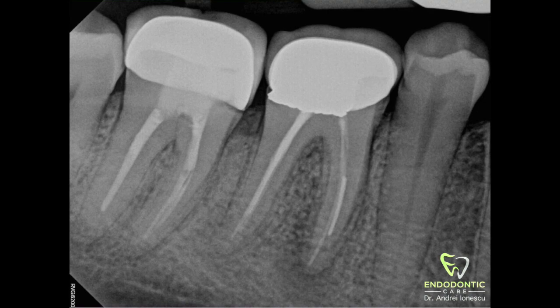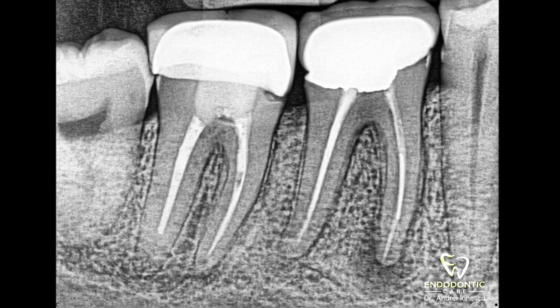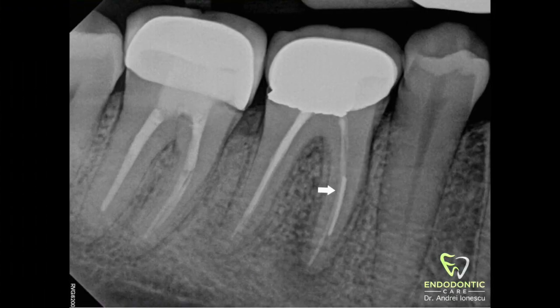We're going to be looking at another case today. This is another broken file removal — tooth number 46, with a separated instrument in the mesial lingual canal. This case was referred to us to remove the separated piece and take care of the infection.